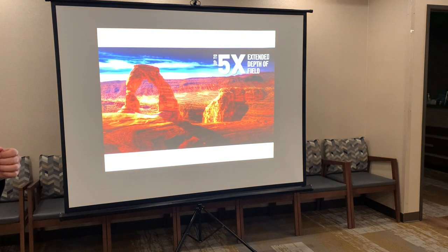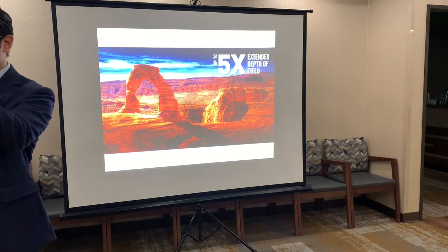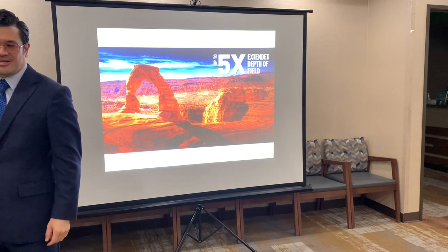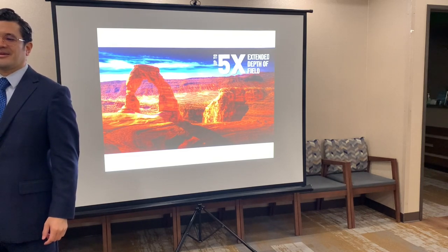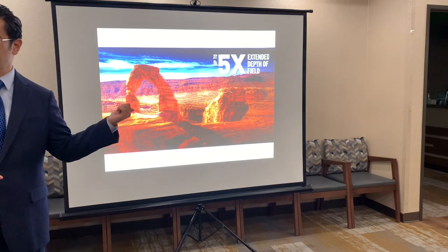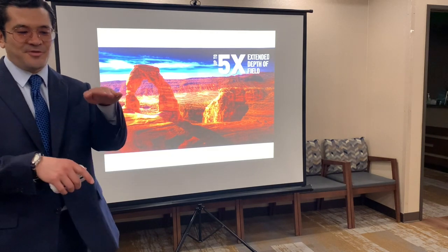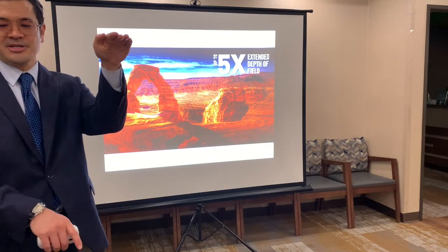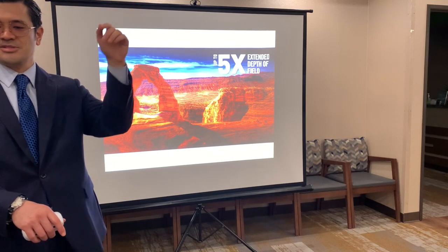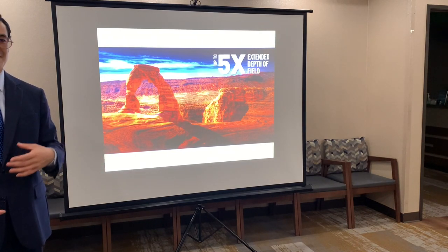So depth of field, I think Kate would understand this, you're a photographer. When you're focused on someone's eye doing a portrait, sometimes the back of their ear is out of focus, and you don't get the whole screen in high def. Well, if you're using a digital processor instead of a microscope, you can get the whole eye in focus. And I see this when we do surgery. I will be focused on the cornea, but the cataract is out of focus. Or then I zoom in to the capsule, and now the cornea is out of focus. So with a digital processor, we can get everything in focus, and that gives us an entire view of the eye.